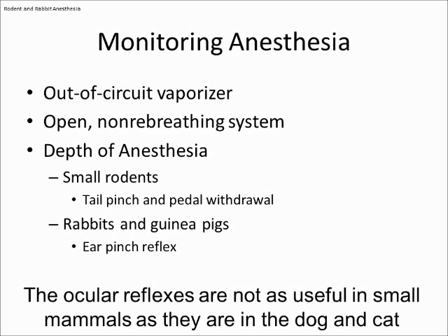These devices are so sensitive, they actually create a lot of resistance to airflow. So the in-circuit systems are those old school ones that I showed you that I had to look up on a museum's website because even I've never seen them. The Ohio 8, the old school anesthesia. So the out-of-circuits are the ones that we're typically used to. I just want you to get very comfortable with out-of-circuit and in-circuit concepts. You'll see a whole different bunch of ways in terms of how you buy, work with, or repair these devices. You need to know all the lingo.